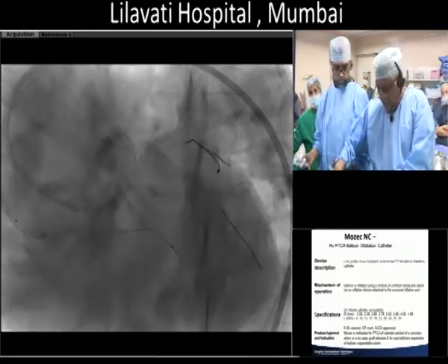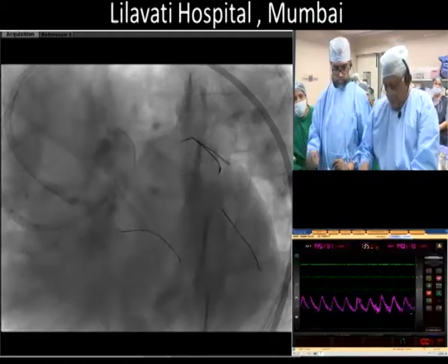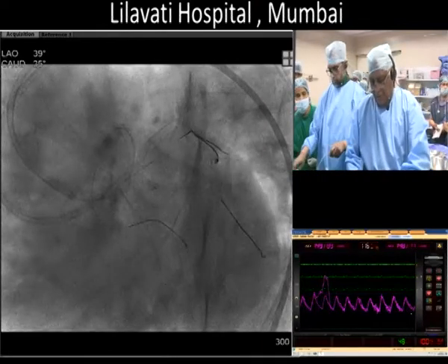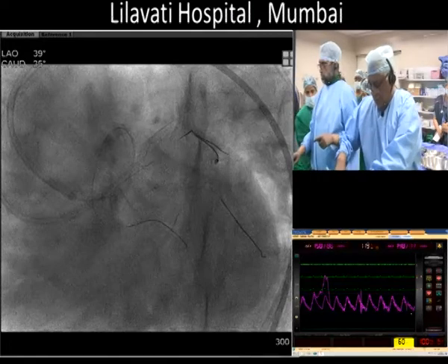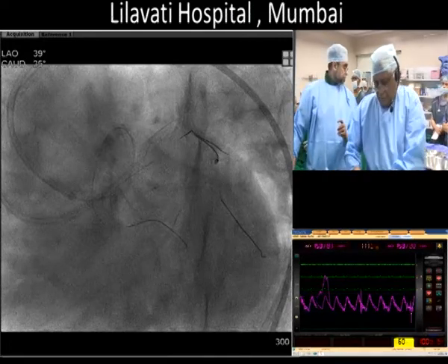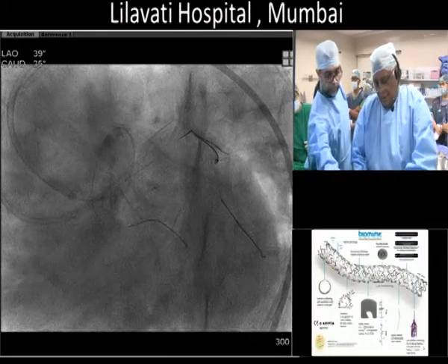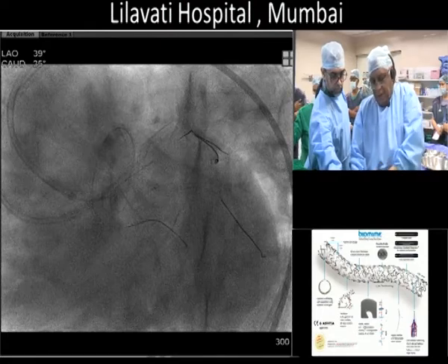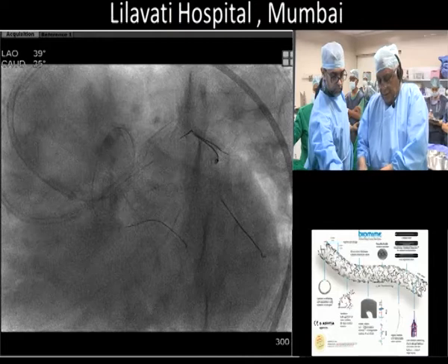Okay. So what's your plan? I'll have a short stent in the ramus and one more post dilatation, and that's it. Wonderful.